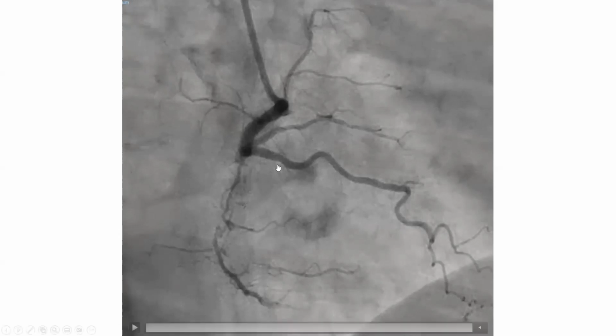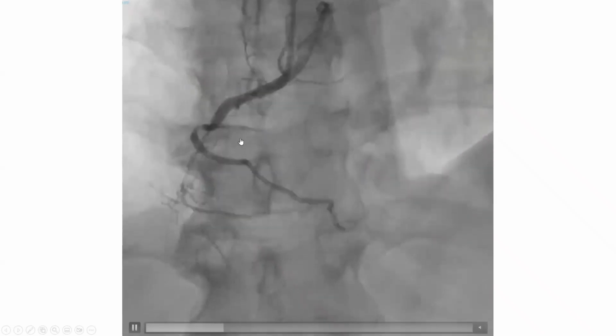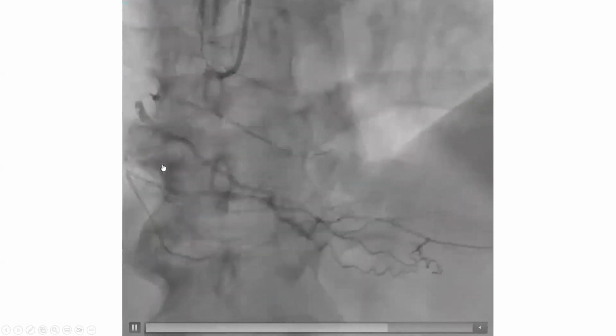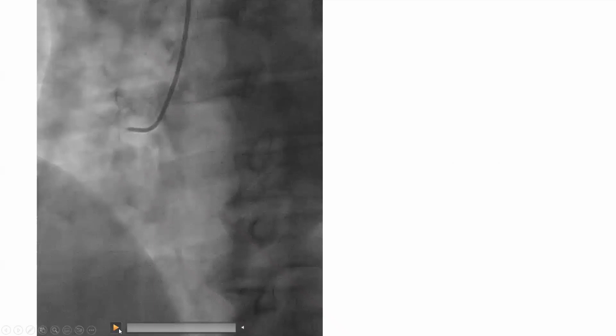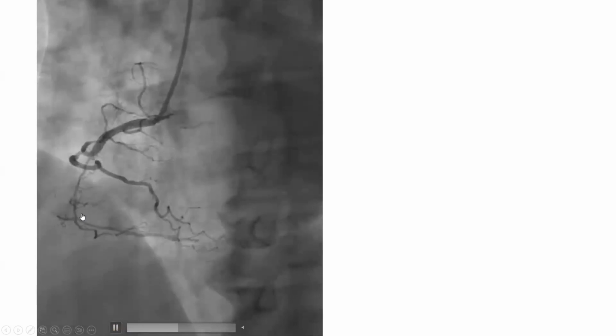morphology of that stenosis suggests this is a complete CTO and those are bridging collaterals, and you should not wire those. Again, look at that bunch of flimsy caput medusa around that area. Very important, because the fellow with me here wanted to wire and stent this. No.